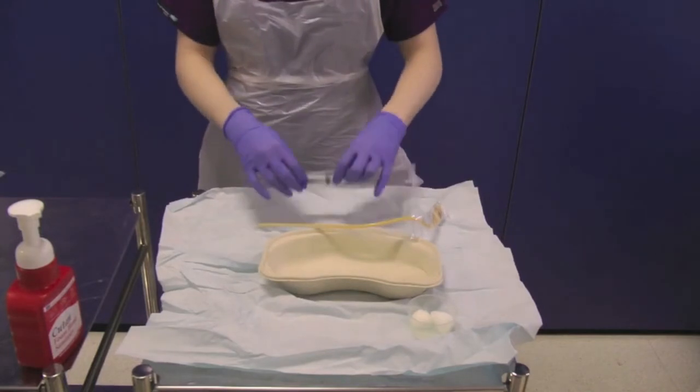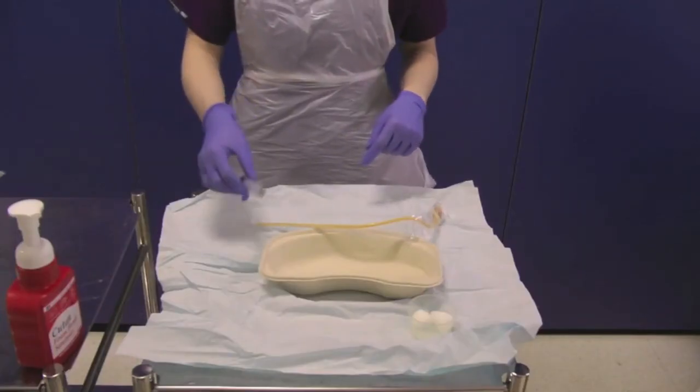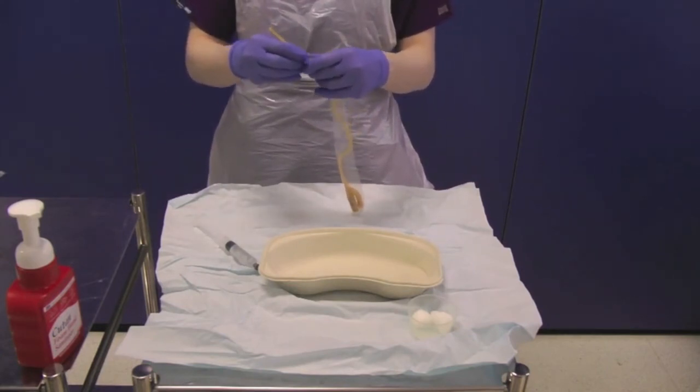Open the 10 milliliter syringe from its sterile packaging and leave this on your sterile field. Open the urinary catheter from its sterile packaging using the perforations to help you, exposing the catheter tip only.